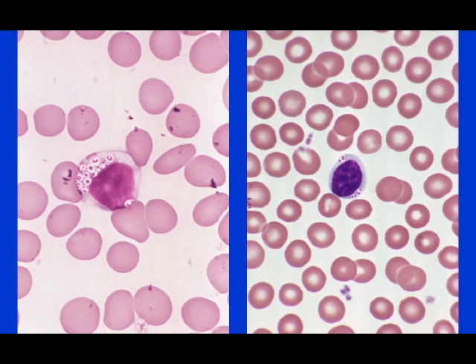Another disease we encounter in bone marrow and blood is mucopolysaccharidosis. And what we encounter in the mucopolysaccharidosis, of which there are about 7 variants, Hurler disease being most common, then Hunter, Sanfilippo disease, and so on and so forth. But what they have in common is many of them deposit mucopolysaccharide in various hematopoietic cells, including lymphocytes, monocytes, and even granulocytes.